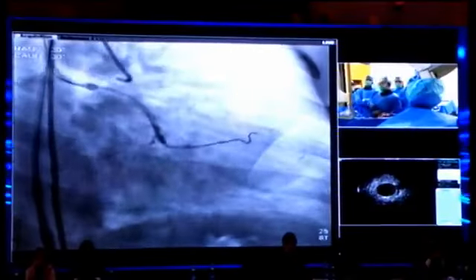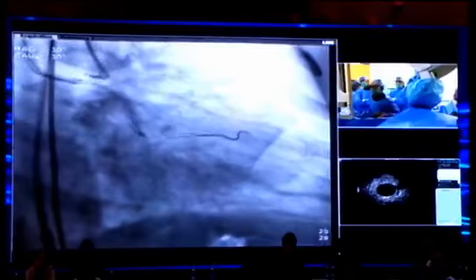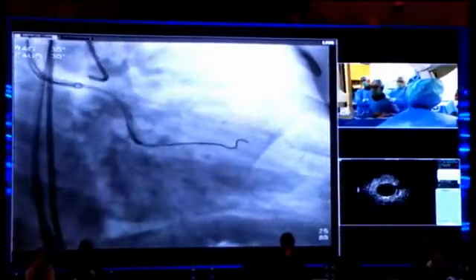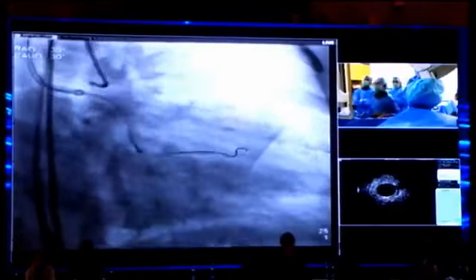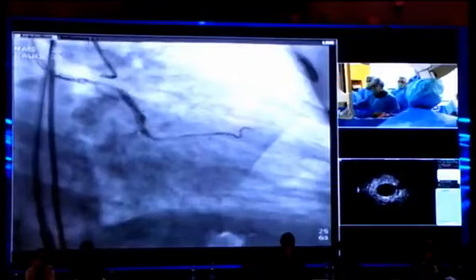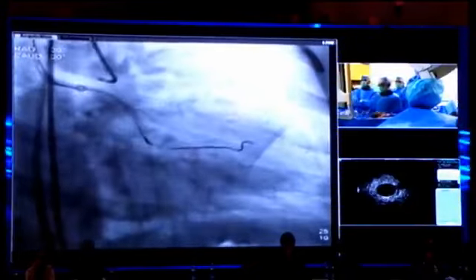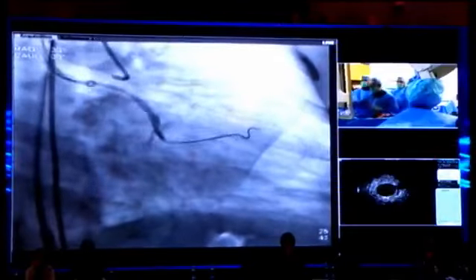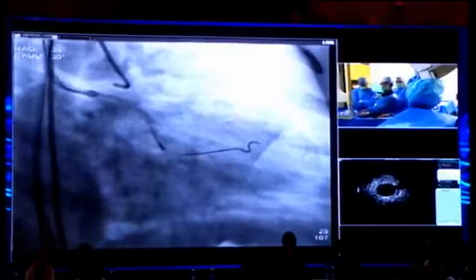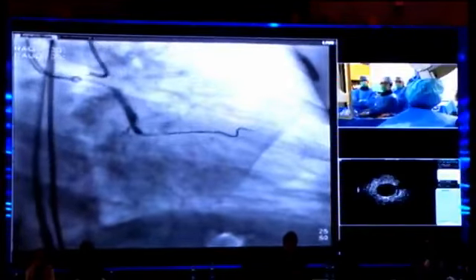Even if I use a double lumen microcatheter and select and isolate this branch, we cannot see a good microchannel. Okay, please discuss which guide wire is better as the first guide wire. Dr. Matsu, any comments? He's asking which antegrade guide wire would you select?